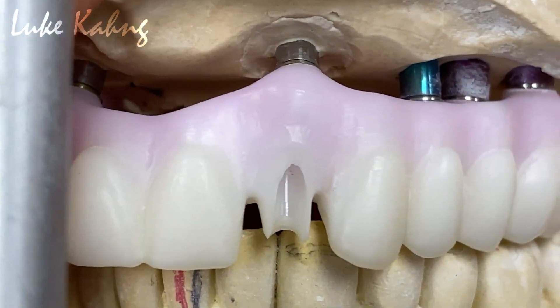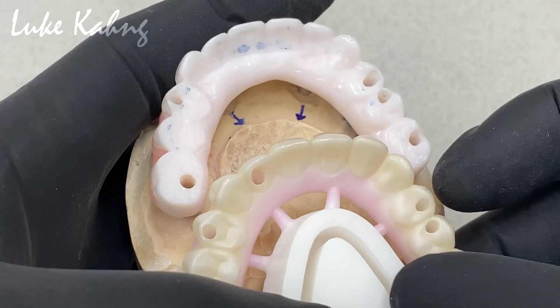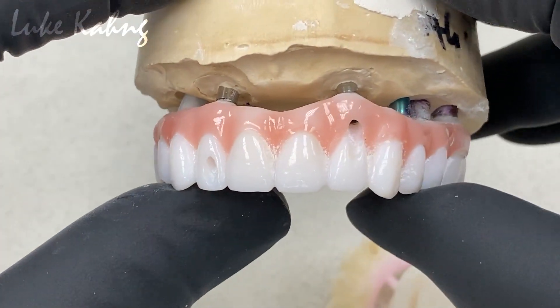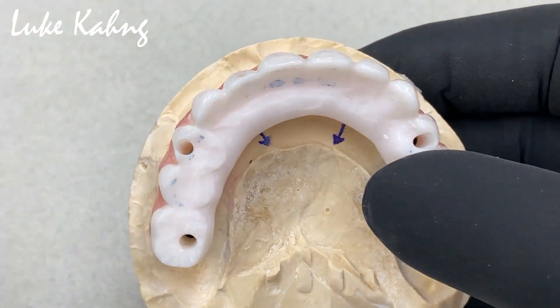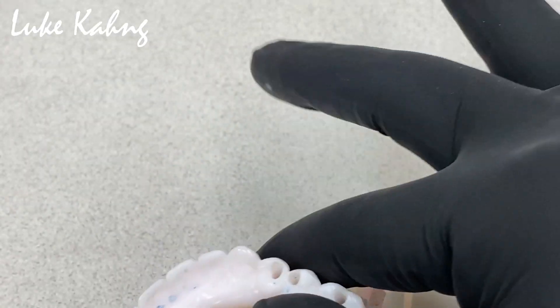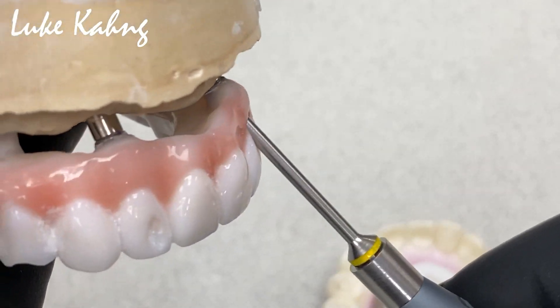We had to be diagnosed with two implants which are really sticking out facially. This is the try-in basis — this is what we say, trying to bring in the angled screw channels. This one is huge facially, out that much in that direction, which is really far off.